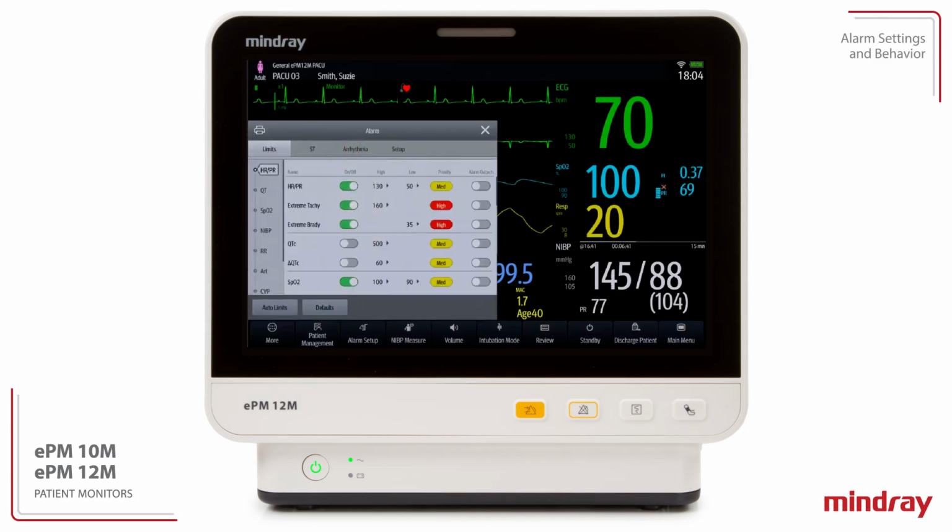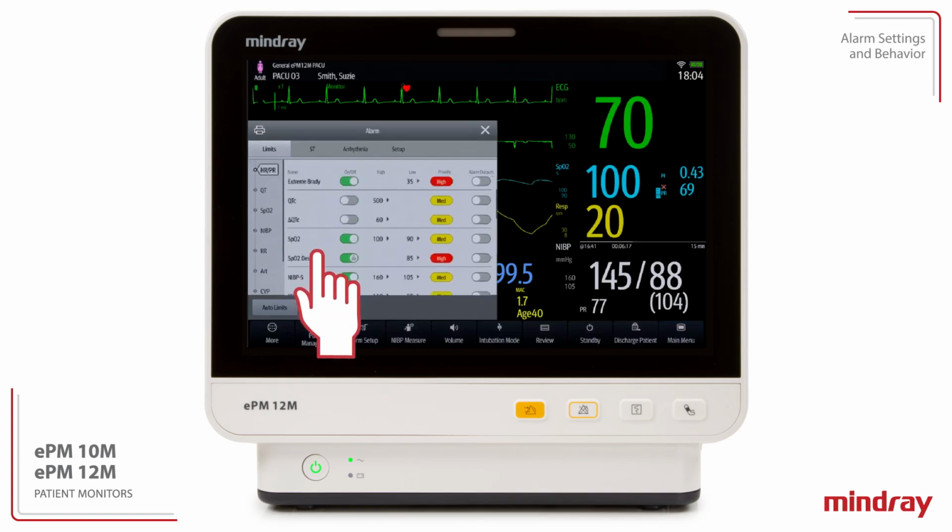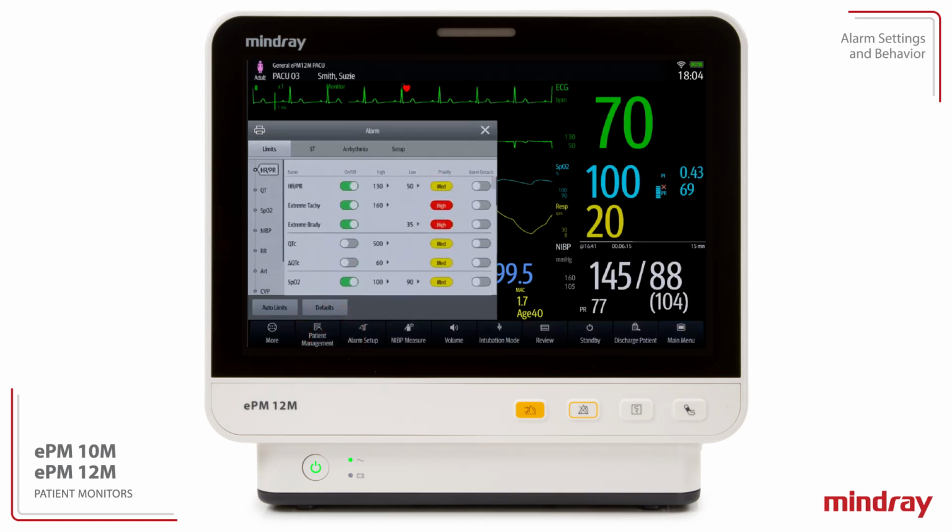Within the Alarm dialog, the Limits tab provides access to all physiological alarms. Functions include an on-off switch, high and low limits, priority, and alarm outputs. Select a parameter within the Limits column or scroll within the main body of the Alarm dialog to access all parameters. In the On-Off column, a green switch indicates the alarm is on and active.